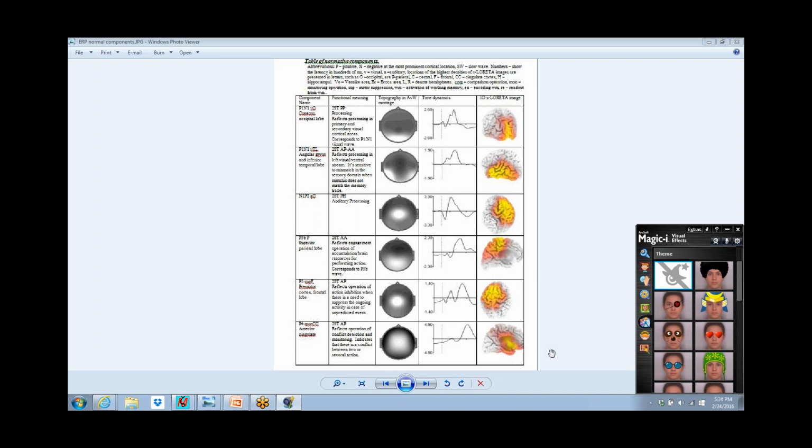Other people later said, well, we can use the LORETA to predefine an area and then feed it back. And that's actually been done very nicely. They've shown that it's capable of being done, and they got similar contingent behavioral responses, having not just stuck electrodes on the surface like one electrode at Fz with a couple of electrodes on the ears. You have to put on the full cap to get the LORETA solution to end up feeding it back. So, it requires a 19-channel amp and thus more expense than a 1 or 2 channel EEG feedback device. So we know there's cost to it, but it's entirely possible to do it.